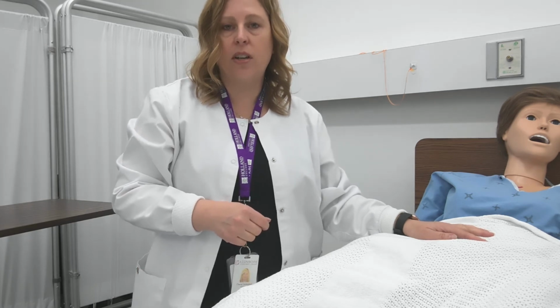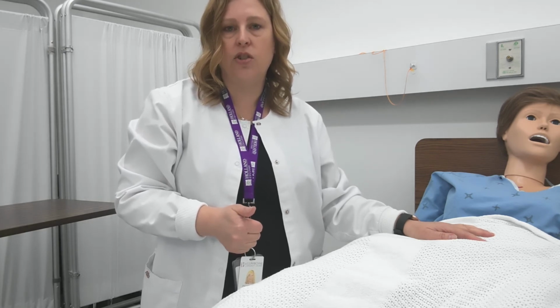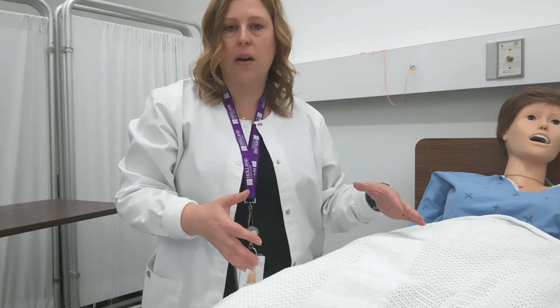I'm also going to document in my client record when I remove the catheter and how my client tolerated the procedure. I'm going to want to put a collection hat in the bathroom so that I can basically monitor how much urine output they are actually putting out.